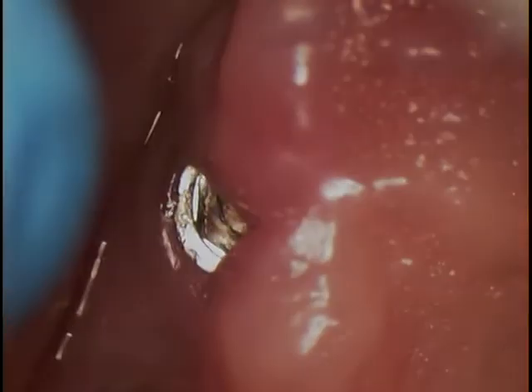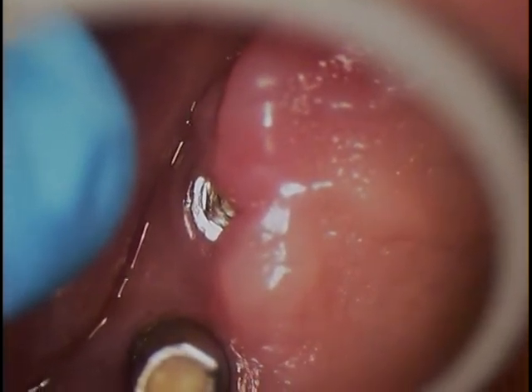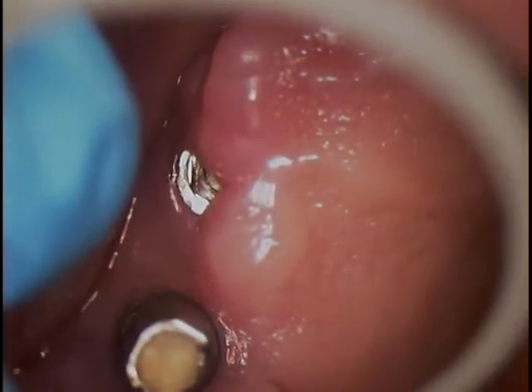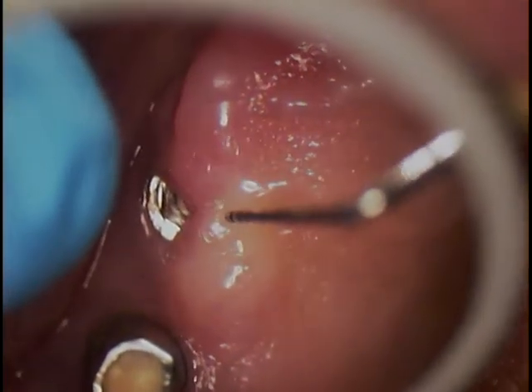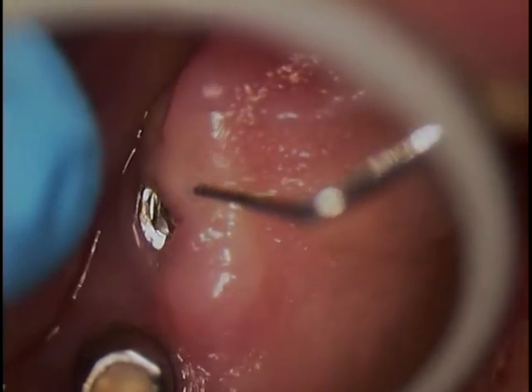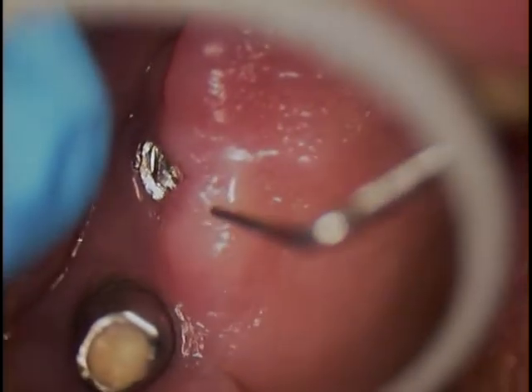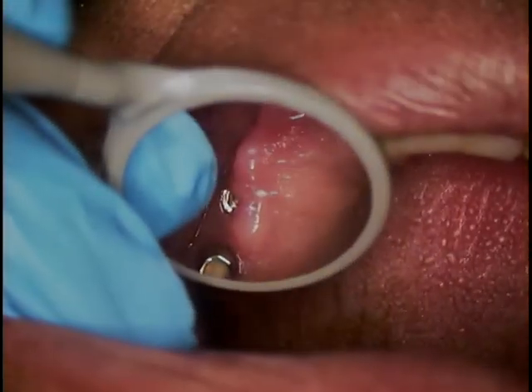Once I get the tissue out of the way, we'll be able to visualize this a lot more and then test it for any mobility. That's step one. I'm going to test that tissue — let me know if you feel this at all. Nothing tender? A little bit? We're going to give you a little bit more anesthetic, just so you don't feel it at all.